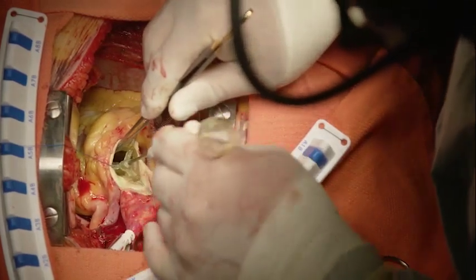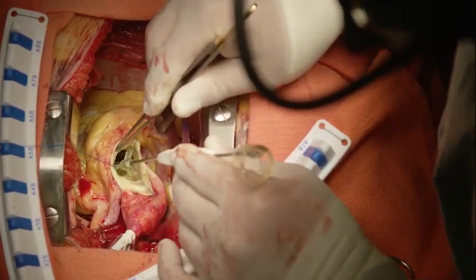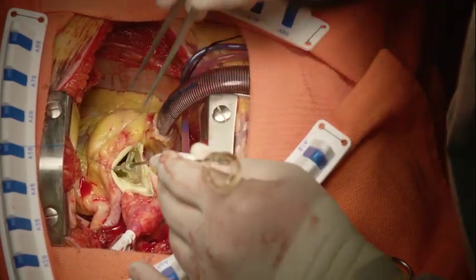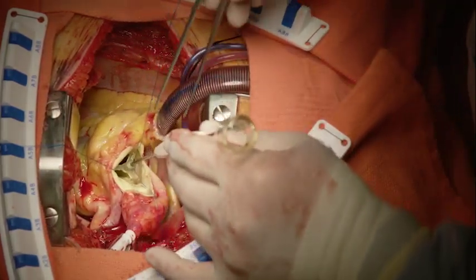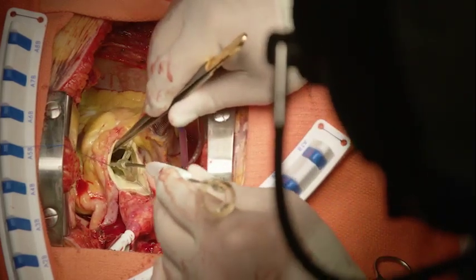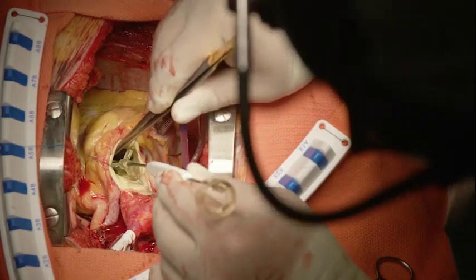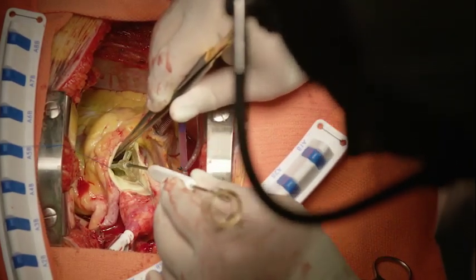When the replica sizer is in place, it is important to gauge the amount of annular tissue that is visible when looking down through the sizer. Too much tissue can indicate that the selected valve is oversized, even though it may fit into the aortic root. Minimal tissue is a good indicator that the replica is the appropriate size for the patient's anatomy.